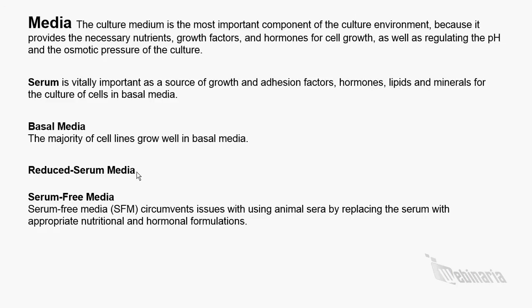Reduced serum media. It's another strategy to reduce the undesired effect of serum in cell culture experiments. Reduced serum media are basal media formulations enriched with nutrients and animal-derived factors, which reduce the amount of serum that is needed.